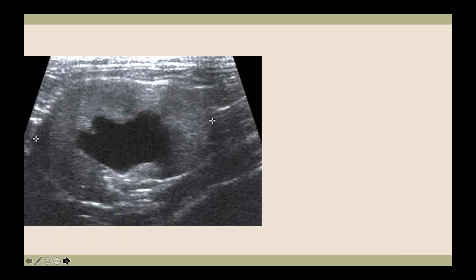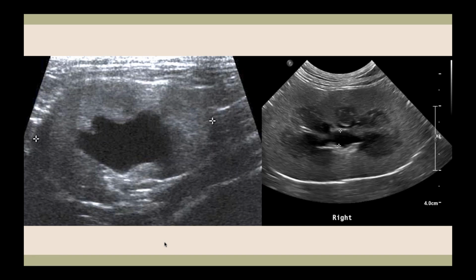And what happens when we see a kidney that looks like this? This is where, as I was responding to Ewan's question, we have pyelectasia, where there is a widened renal pelvis, but also the diverticula are blunted. We can see that everything's kind of retracted backwards. So is this just a kidney that has CKD, or does it have obstruction? This has a much smaller renal pelvis, I think only about 3.5 millimeters. This pelvis, I think, was estimated to be probably about 8 millimeters or so, at least, maybe a little bit bigger. So are both these kidneys obstructed? Is this just what we see in chronic kidney disease?